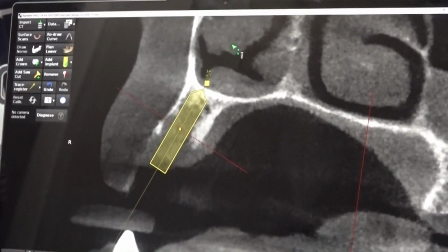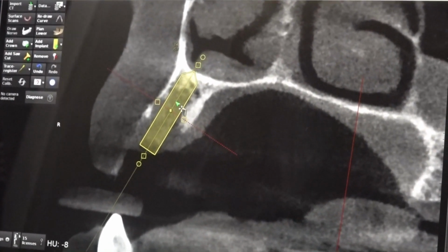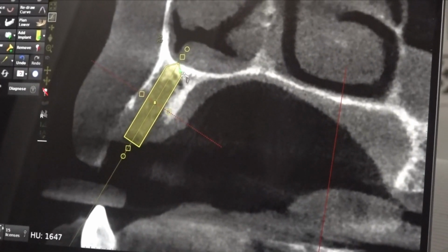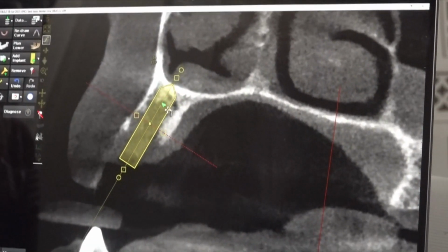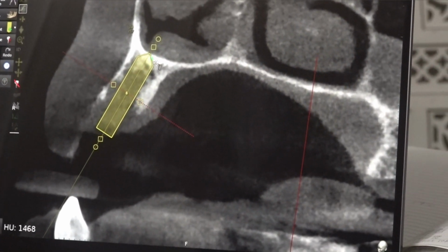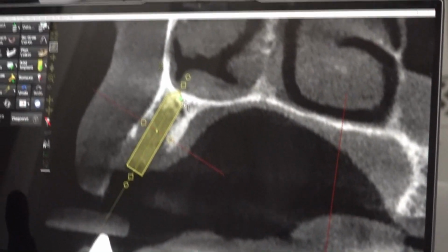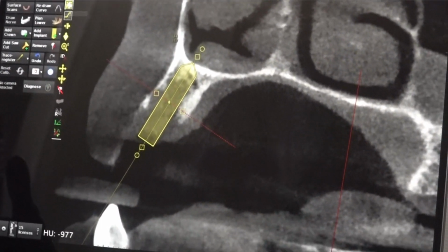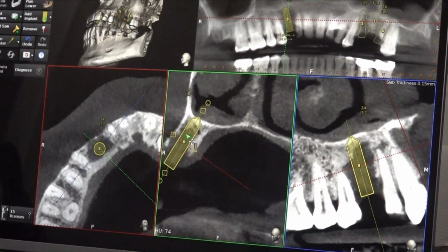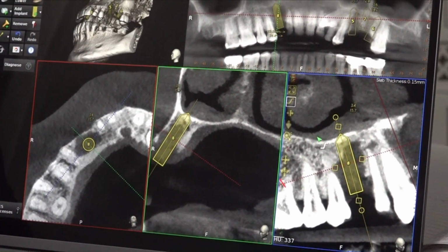We have to check whether the patient is taking vitamin D and all properly. If necessary, we can take more tests. You can place a BCS, but the risk is more because you are getting stability only from this part. Of course, the nasal floor is very good, 1500 HU. Or another option is you can place the implant and do delayed loading. Yes, that also you can do.